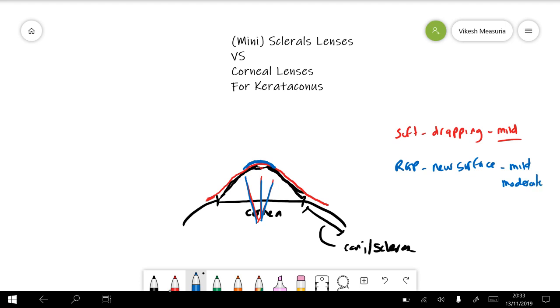The challenge with that is that it's physically resting on the surface of the cone. If the cornea is quite sensitive, which it can be with people that suffer from keratoconus, sometimes they can get ill effects on comfort, and in some cases that can rub on the cone itself and cause a little bit of scarring, potentially causing some impact to the vision. So as long as it's fitted well, not too much of a challenge, but there are various things that we need to bear in mind.